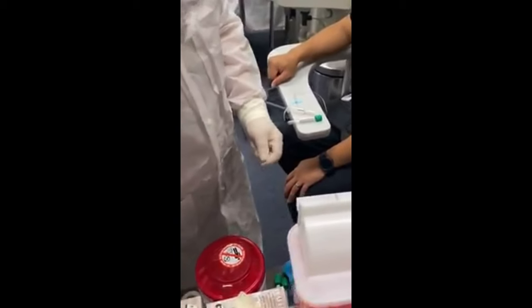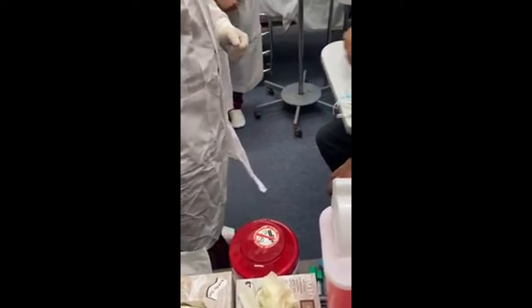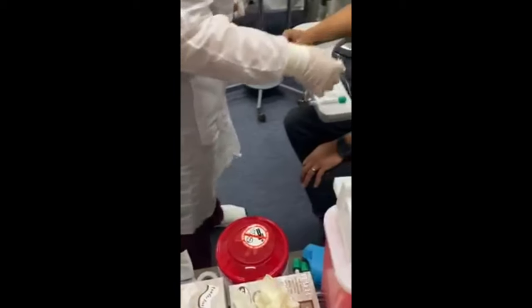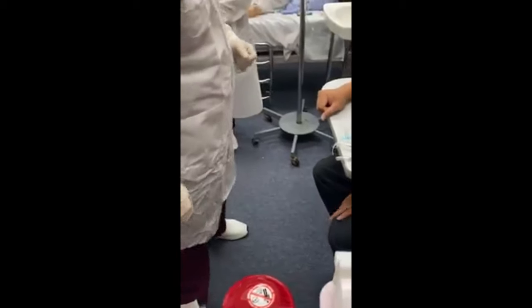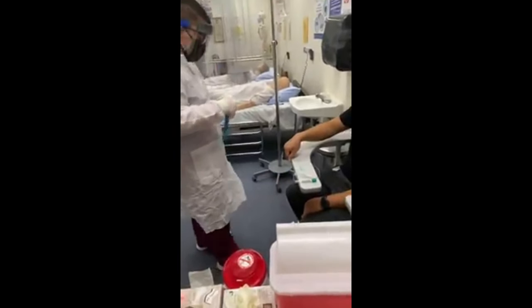Usually, the first time I see a needle, I'll be like, oh. Can I already prepare the gauze too? Yeah, you can. Definitely. So just prepare everything how you want it, so everything's within reach. As long as it's within reach, it should be good. Okay. Alright, sir, here we go. We're going to get your blood now.